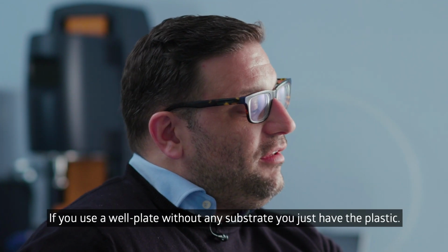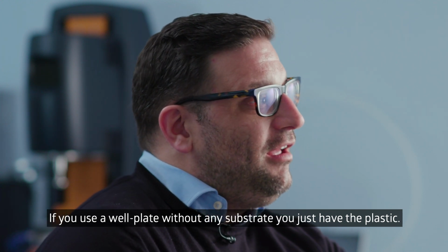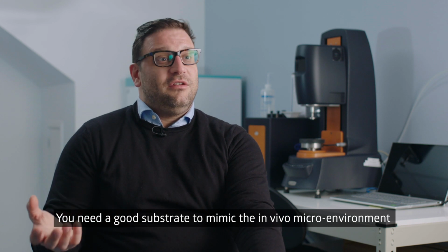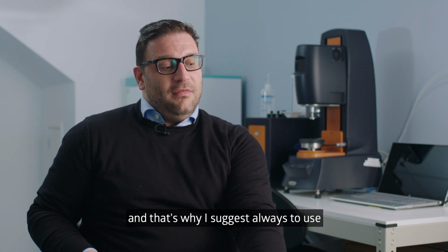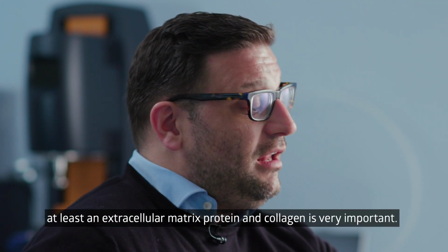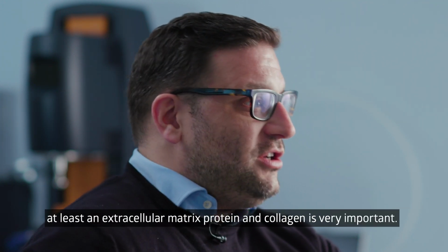things. If you use a well plate without any substrate, you just have the plastic. It might be a very good control. You need a good substrate to mimic the in vivo microenvironment, and that's why I suggest always to use at least an extracellular matrix protein, and collagen is very important.